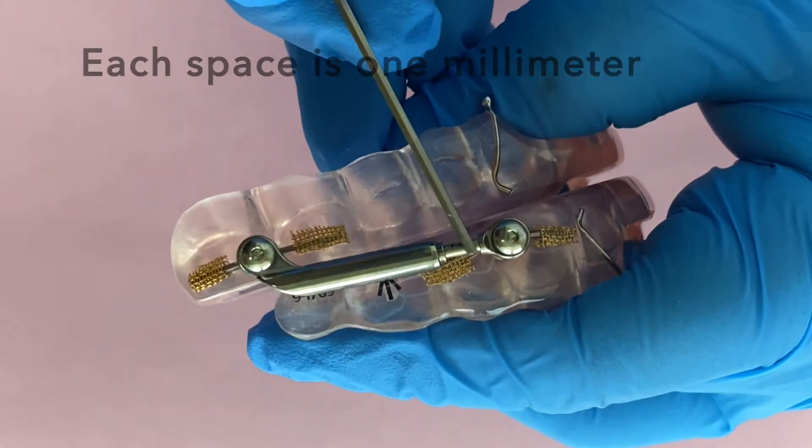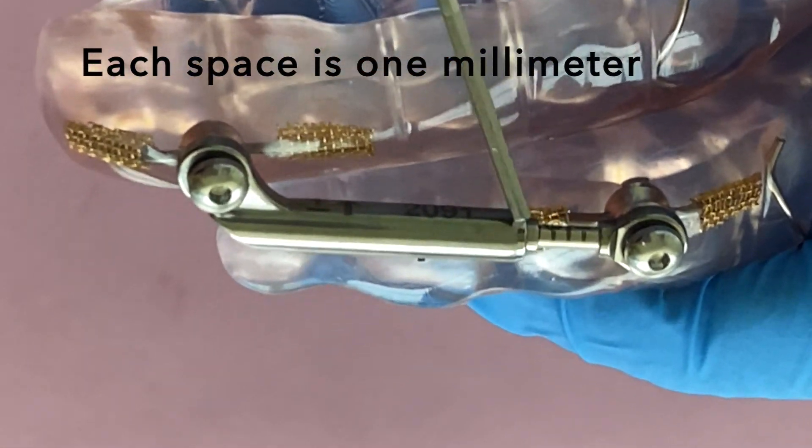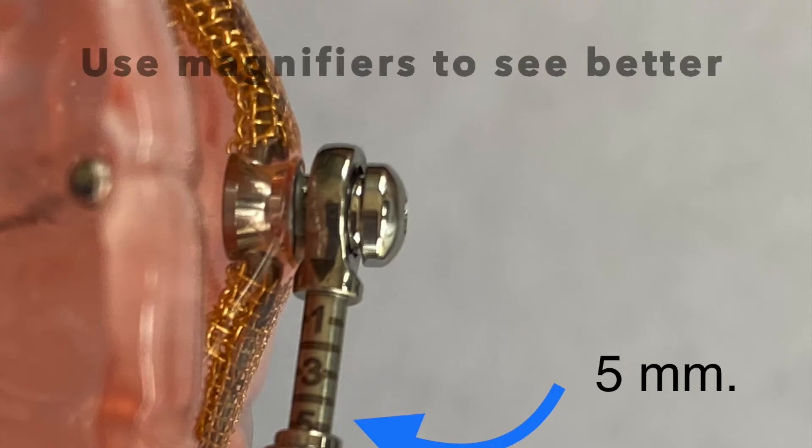Now if you're ever confused about whether you advanced it correctly, over time you're going to start seeing lines on your device being exposed with numbers on them. Here's a sample of both sides that were not correctly advanced — one side has five millimeters, the other shows three millimeters — and this is where you would want to level them out, either both to five, four, or three. I strongly recommend using some kind of magnifier. A lot of my patients use the iPhone magnifying feature, which with the light and magnification really blows it up to make it much easier to see those lines.